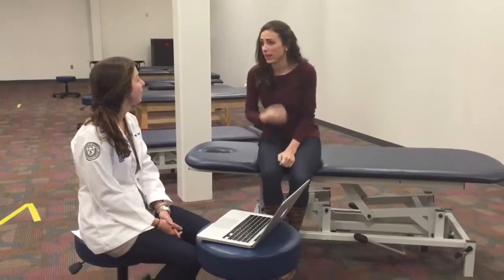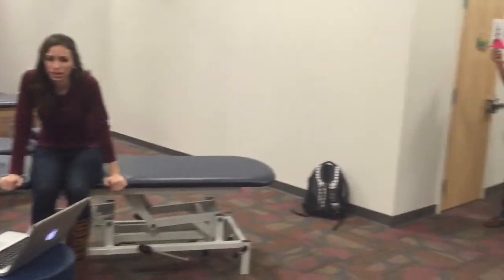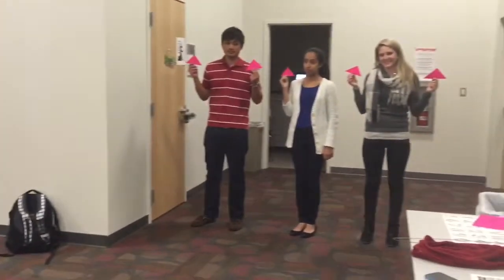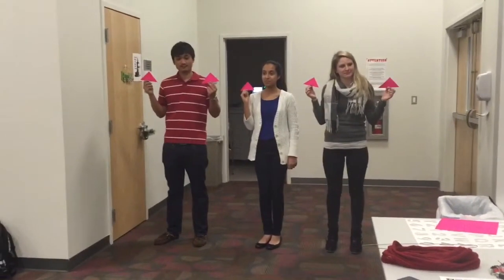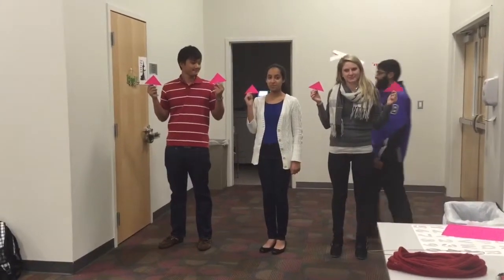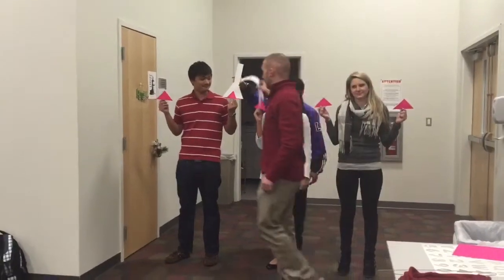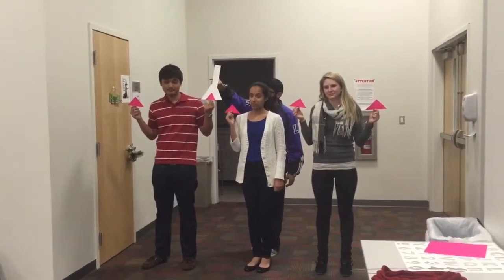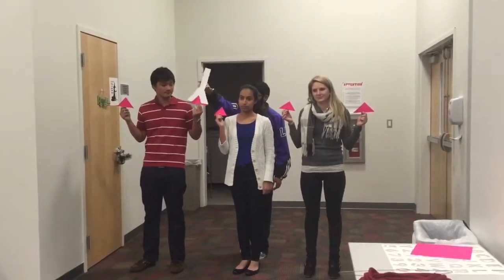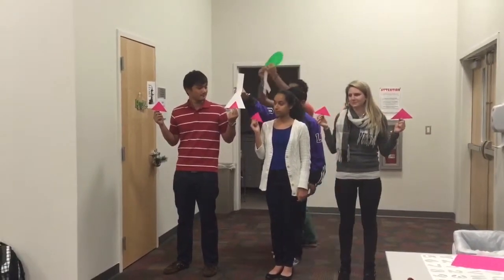What's an ELISA test? How's it going to tell you that I have HIV? Well, don't worry — I'll explain so that you'll understand. The ELISA test takes place to test for the presence of HIV in your blood. You begin with a plate containing the virus antigen. Then your drawn blood, which either contains antibodies against the virus or not, will be added to that plate. This determines whether your antibodies react with the virus. Then the plate is washed to remove non-bonding antibodies, and a color-tagged antibody will bind the bound antibodies to the antigen, and a color change will result.